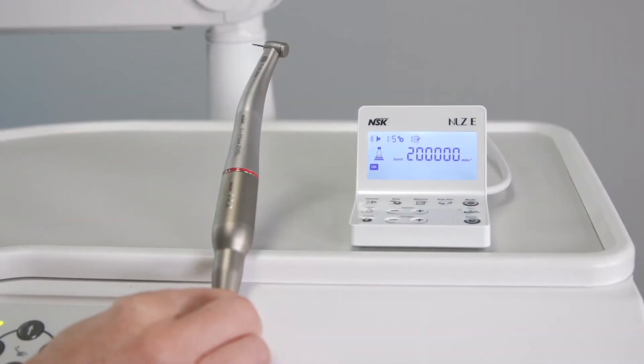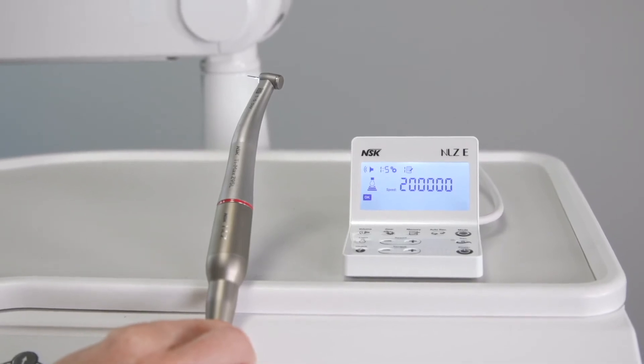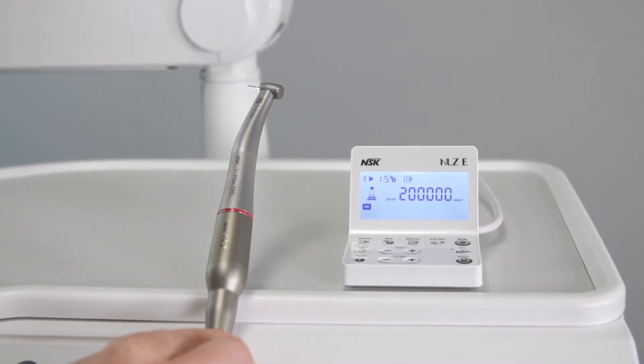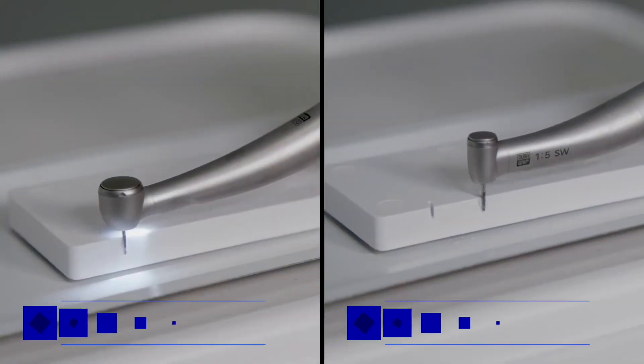Because this micromotor is controlled electronically, the movement is powerful and stable while cutting through different materials. It also allows you to control the speed range. When using a red band together with an electric micromotor, the maximum rpm generated becomes 200,000 rpm. At this speed, the handpiece can cut tooth and restorative materials the same way a high speed does, but with increased power and torque.